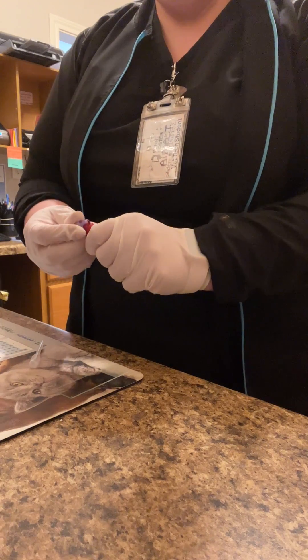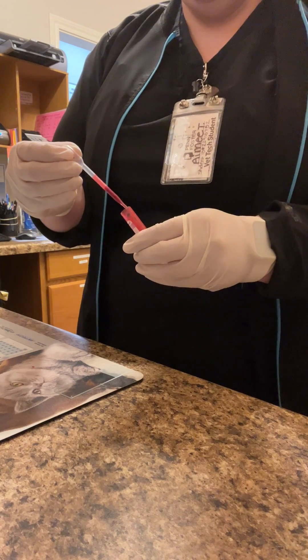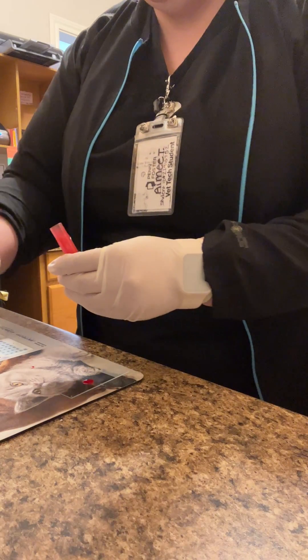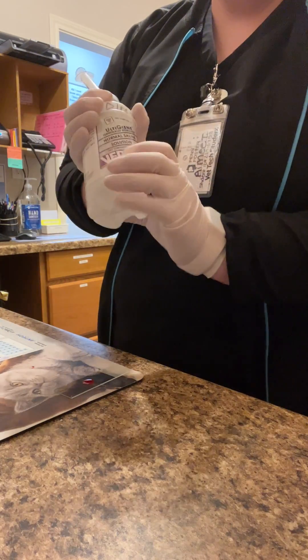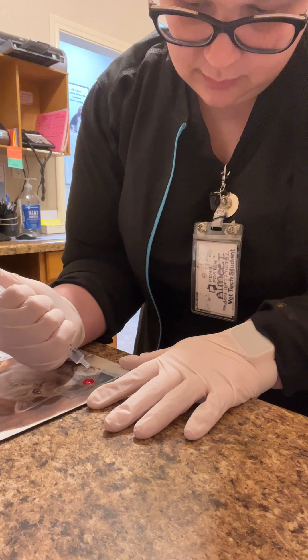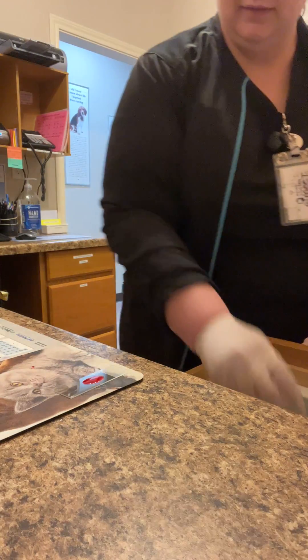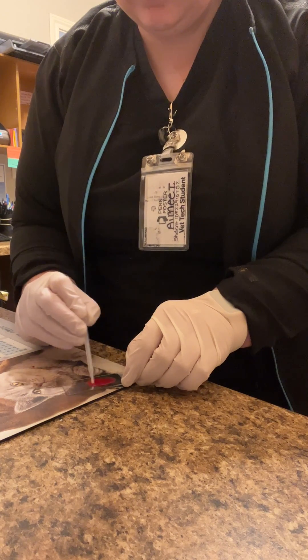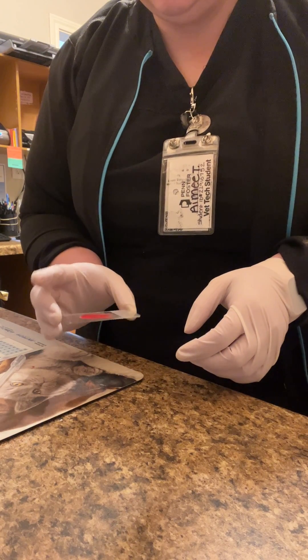I have my EDTA blood. I just drop one drop of blood onto a clean microscope slide, and then my saline, two drops, and a clean pipette, kind of mix it together, and then slowly rock back and forth.